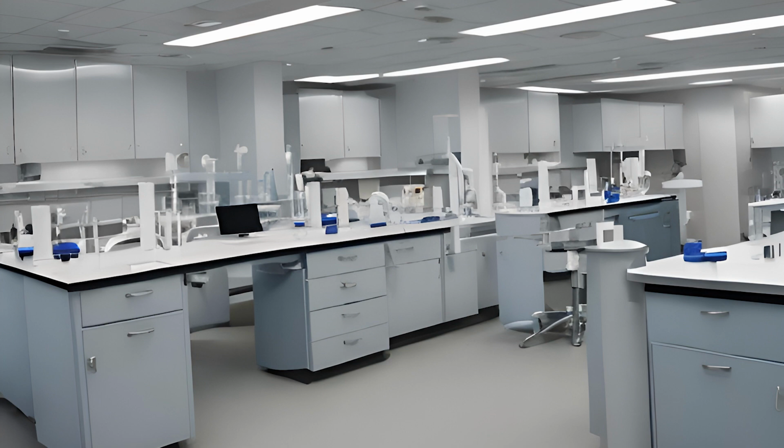If your patient stiffens up like a board, they're likely just going to stay in place, and all you've got to do is get the needle out of their arm, and then just make sure, stand next to them, stand in front of them, make sure that they don't go limp and fall out of the chair. Wait for them to wake up.